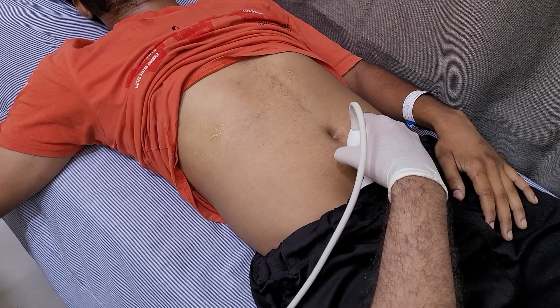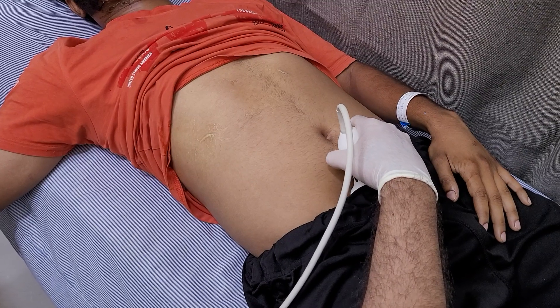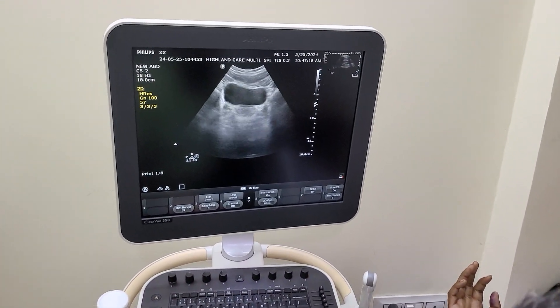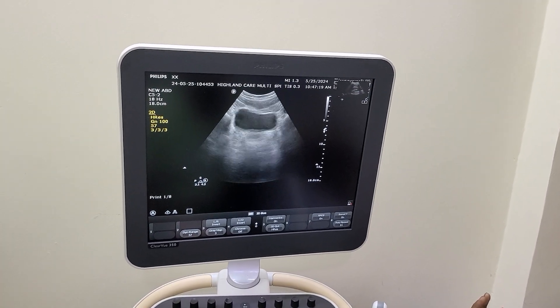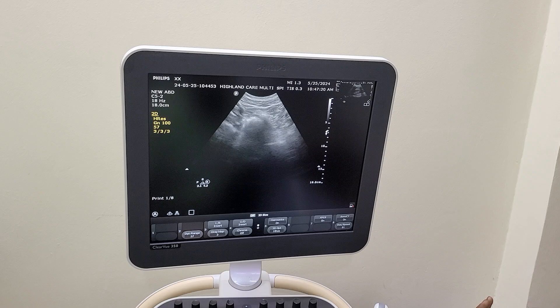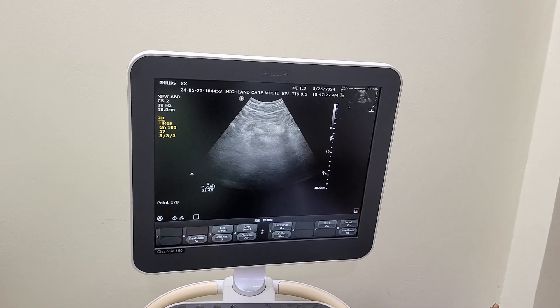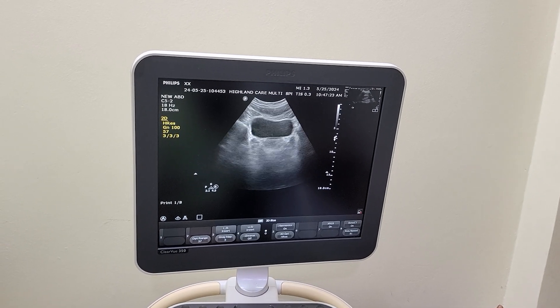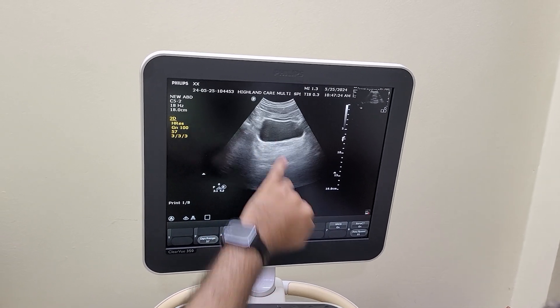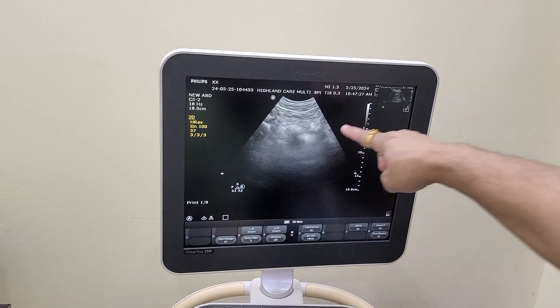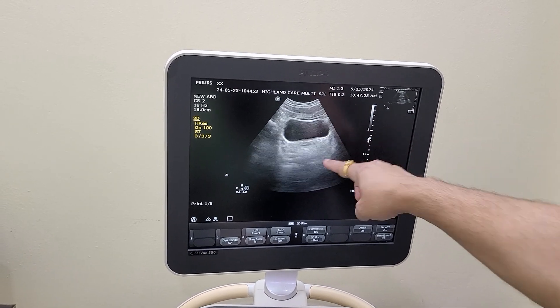This is the Pouch of Douglas that we are looking for. Again, it seems there is no significant collection here. You can see this is the bladder.